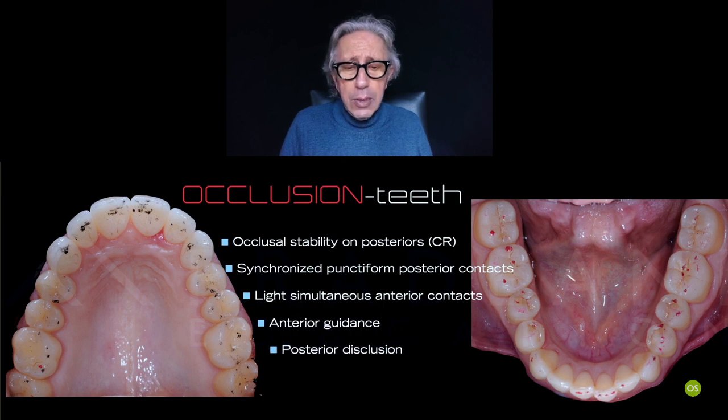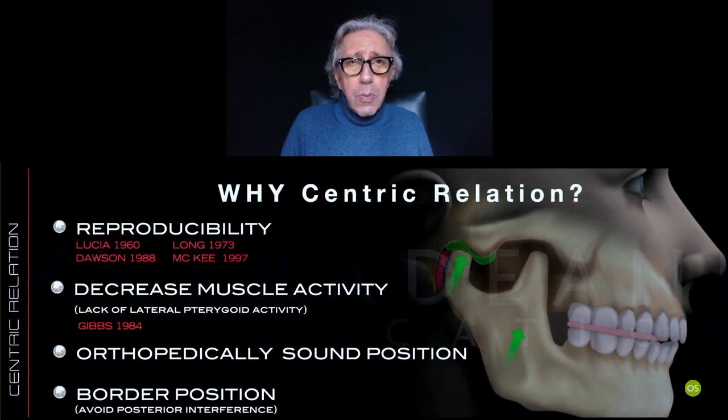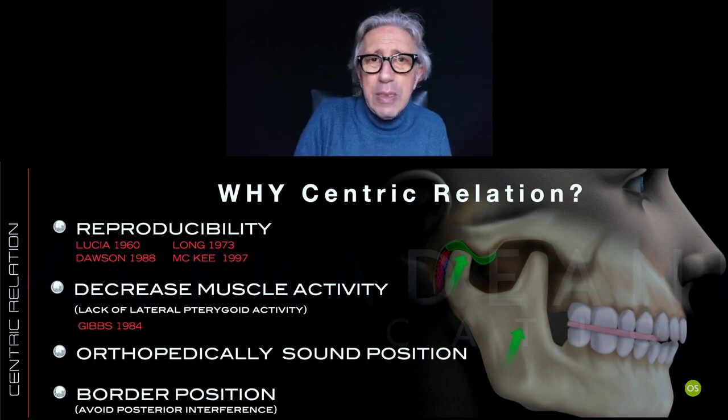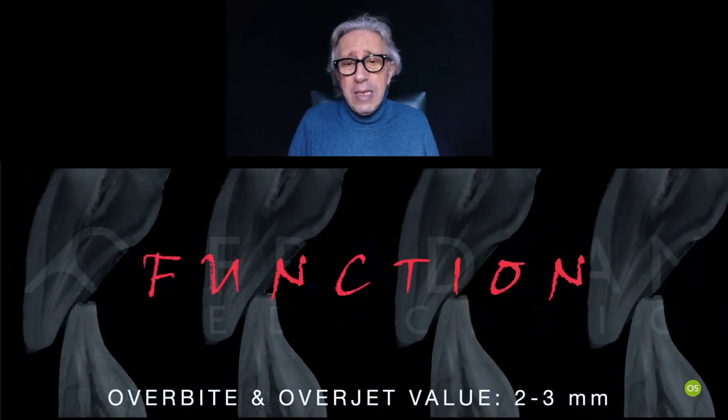And at this point, we discussed this already, we described that. Many steps should have been explained on that, but the most important part is the reproducibility of the position of the mandible. That is what we like to have in cases that are not just a single restoration, but maybe 6 upper anteriors, or maybe 1 arch or 2 arches. So we really need to have this kind of repeatability of the position, and also a decrease of the muscle intensity.